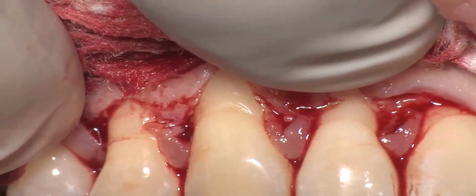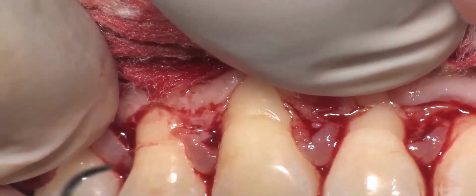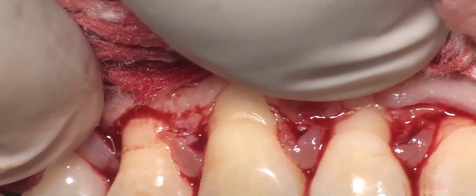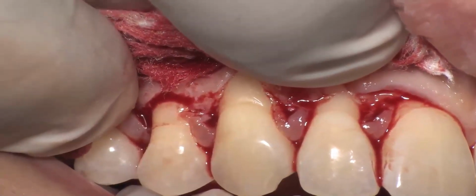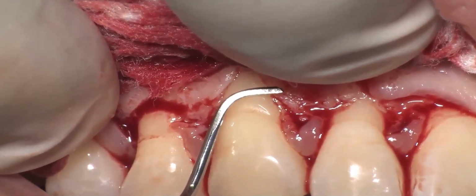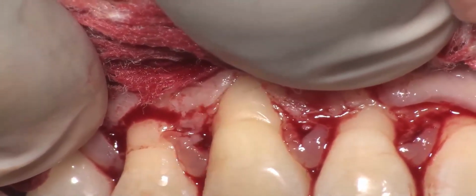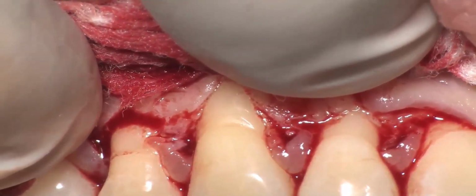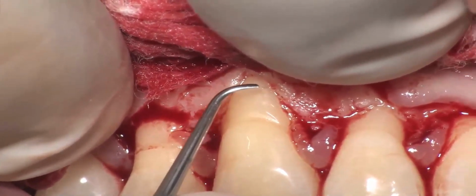This is the new type of curette that I was asked to try, but they are not really something I like to try because it's too big. If you use a curette like this, you see this is a Gracey, how big it is. The risk is to flatten the surface too much, while I'm using this kind of curette, which is exactly 1/3 of the original one.